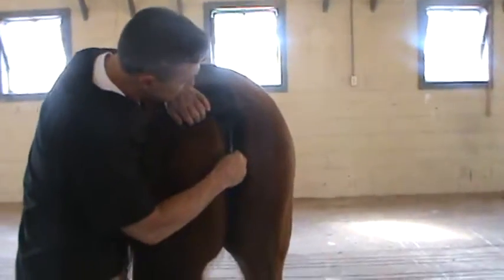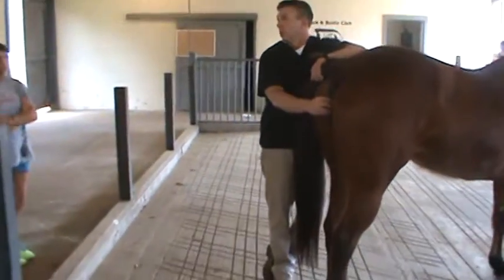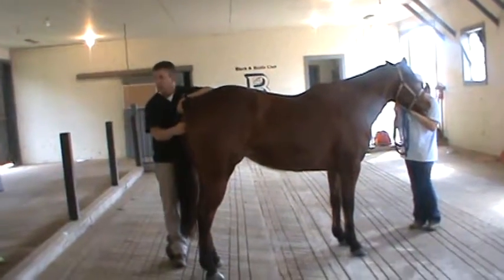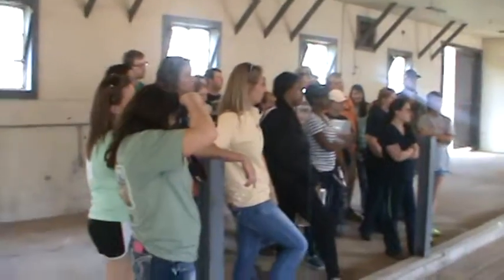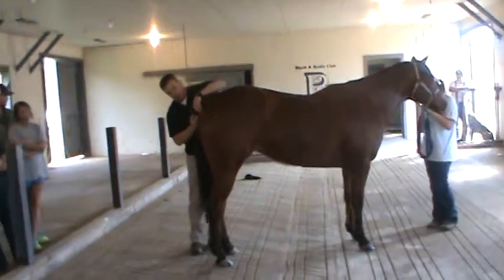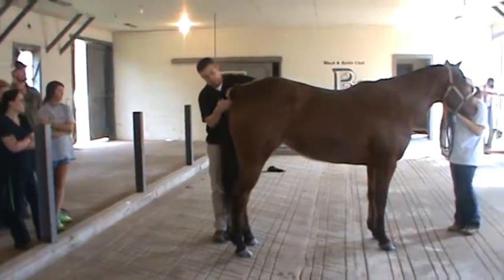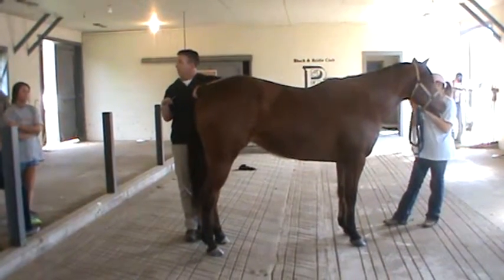This mare, 20 degrees at the most, which is not bad. We would consider that acceptable and certainly normal. Now, ideal, perfect, would be if her rectum actually touched the tip of the syringe, if it was pushed out far enough that it was completely perpendicular. So this mare, when she defecates, it is not going to fall there. There's no shelf, there's no plane for that to get stuck on.